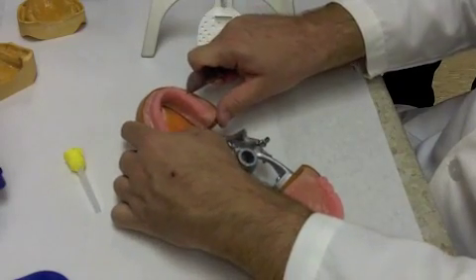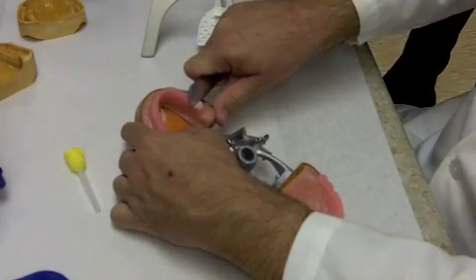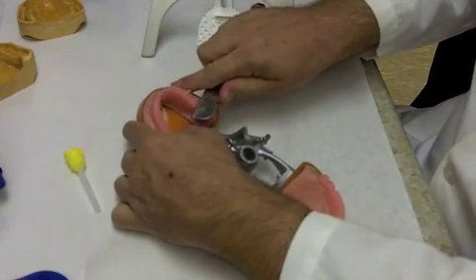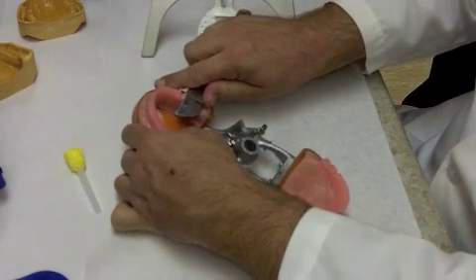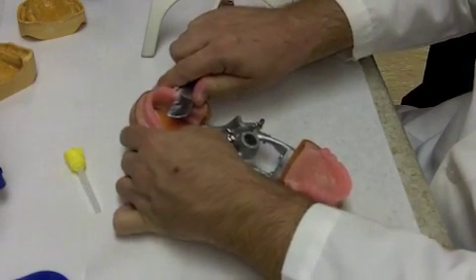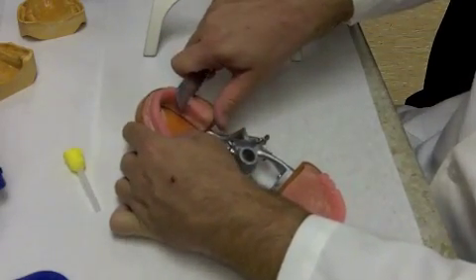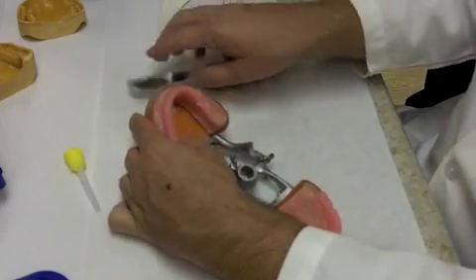The reason for taking this wax out is because you're trying to create space for the registration material. We want to make sure that we don't have rim touching rim. We want to allow a little bit of room for the registration material so the registration material doesn't change our vertical dimension of occlusion whenever we have it in the patient's mouth.